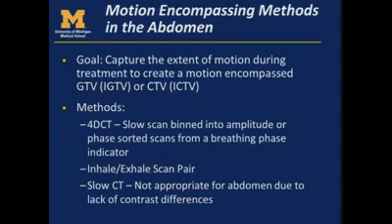If we look at the ITV approach, this I think is by far one of the most common methods used to manage motion. We want to capture the extent of the motion during treatment so that we can capture that for treatment planning. One of the things that I've liked to do more recently is instead of calling this an ITV, use IGTV or ICTV.